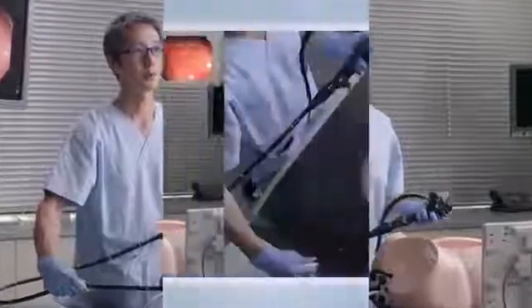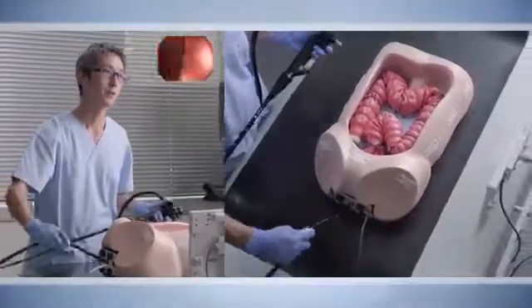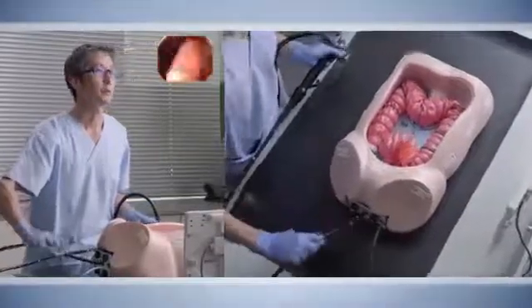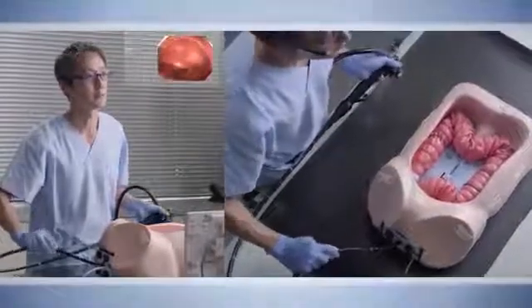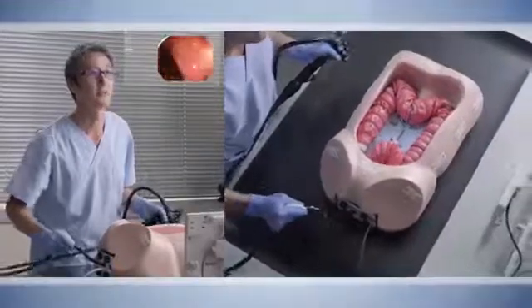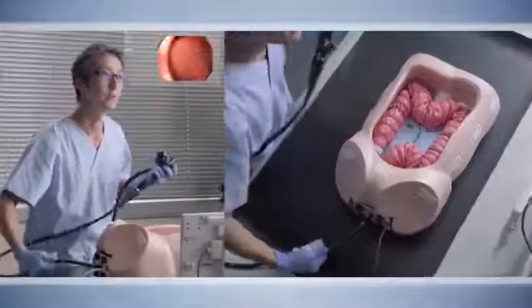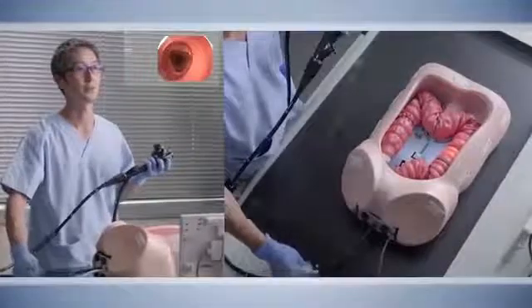The first part of colonoscopy is trying to shorten the sigmoid colon. In this actual demonstration with the phantom, the real goal is to shorten the sigmoid colon without making a loop. You always want to maintain the axis of the colon into the descending colon so that you wouldn't have any loops in the sigmoid colon.